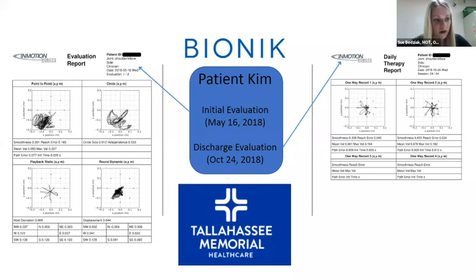As you see on the graphs, her smoothness of movement had improved to 81% of the expected performance on the robot. And this is so important for her functional goal of feeding herself. And the 81% reflected that goal. So we were able to do min assist and set up, positioning the plate as you saw in the video, and a universal cuff for her to be able to feed herself. And then the lower reach error and the path error was also necessary for her feeding goal.